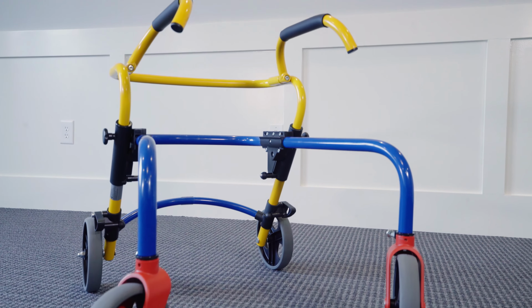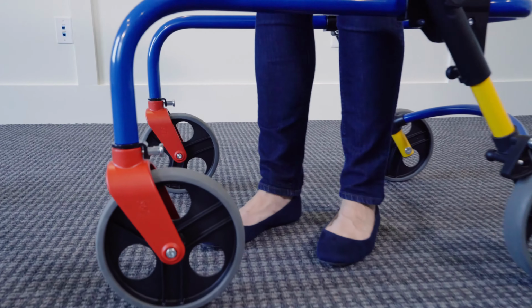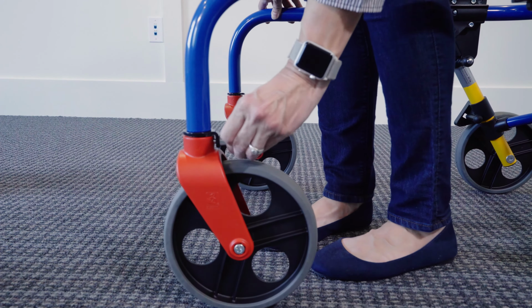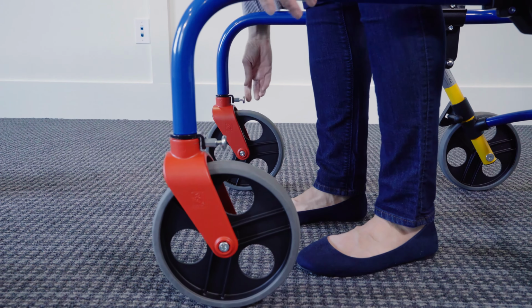As we move down the walker, we'd want to talk about these front caster wheels. These pins in the front offer a locking system. As you can see right now, they don't swivel, and if I just pull that pin out and turn it, and pull this pin out and turn it, I've now made these wheels roll 360 degrees.